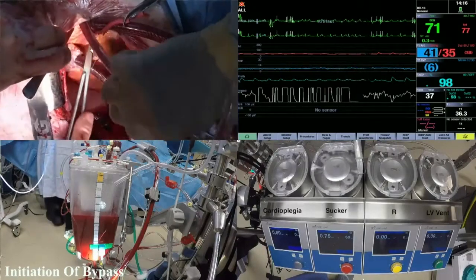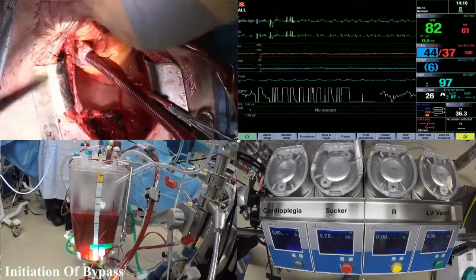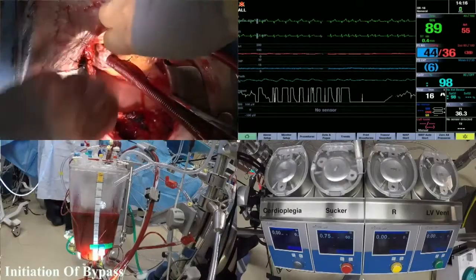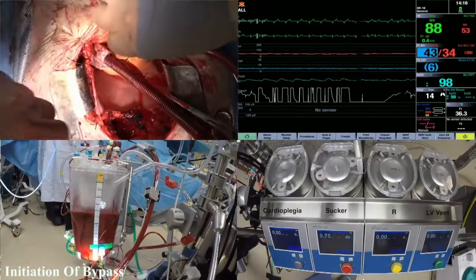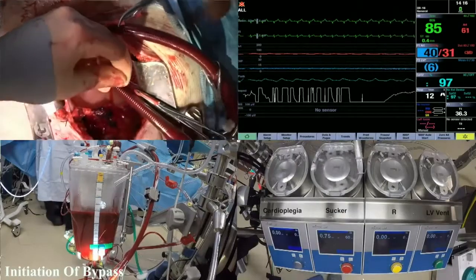Right now, Patrick, have a look at your hemodynamic monitor. But look at your heart, you know, hearts are shrinking up. It's empty. It's shrunk. Yes, I'm glad you're here. Yeah. I've never seen a heart do that before. You're right. I've never, in all my life. Is that red line running? That's all we ever look at. That phone call is coming in.